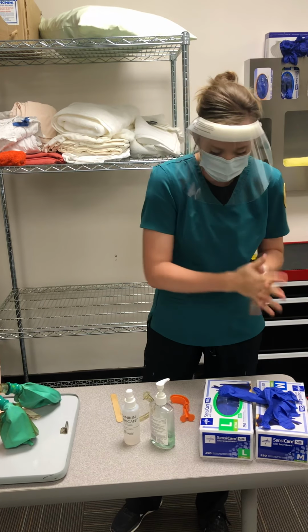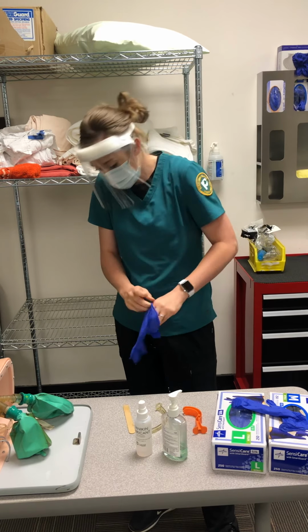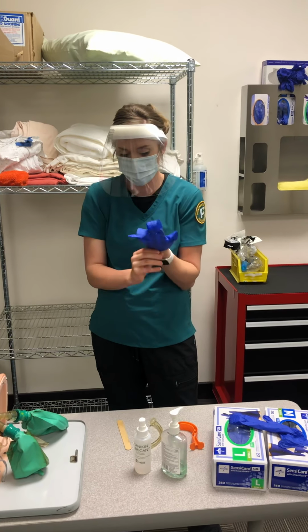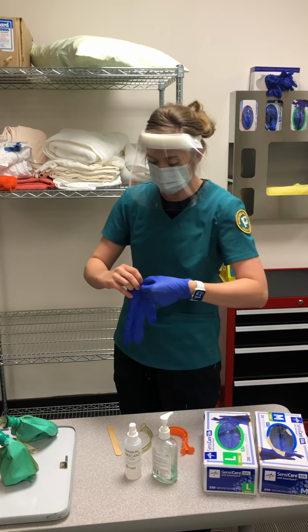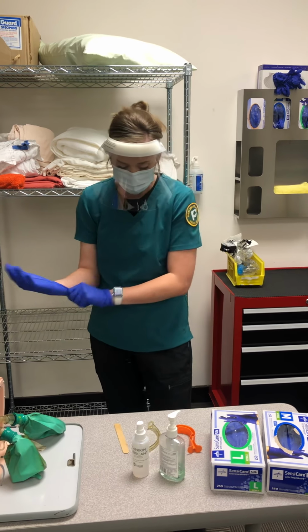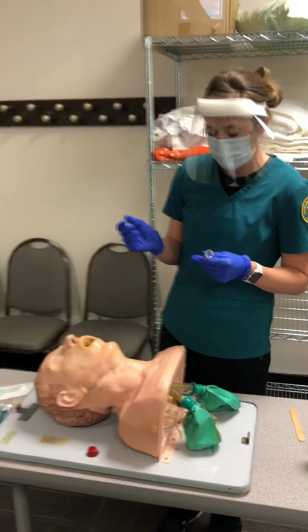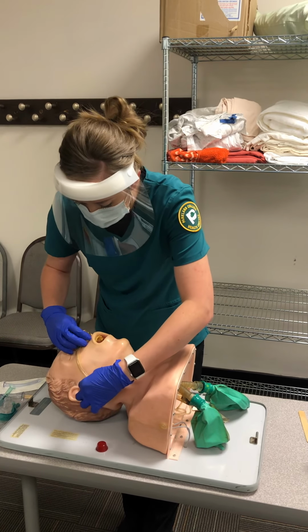Gather all of my equipment. I will assess the patient to make sure that this is the proper airway being used and assess their vital signs. And then to measure, I will place it at the nostril and measure to the earlobe.